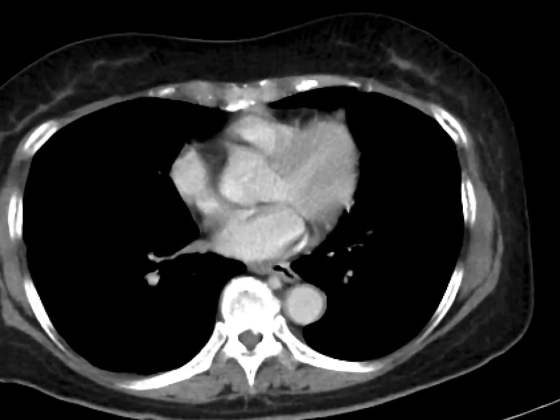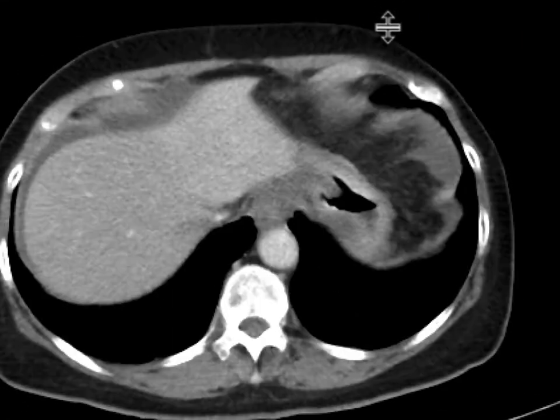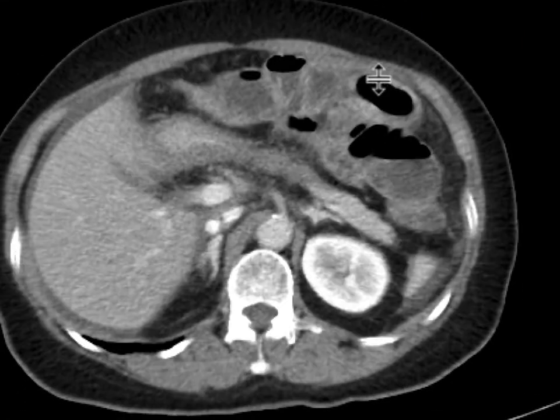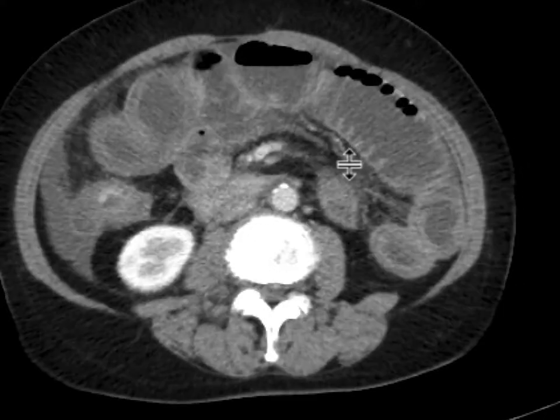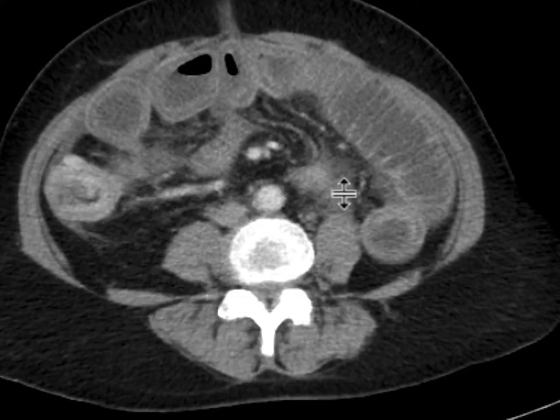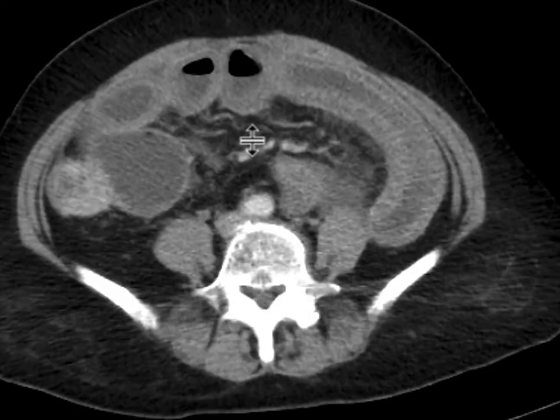This is a patient who came with abdominal pain, nausea, and vomiting. As you scroll down, we can see that there are clearly findings of a small bowel obstruction with numerous distended loops of small bowel.